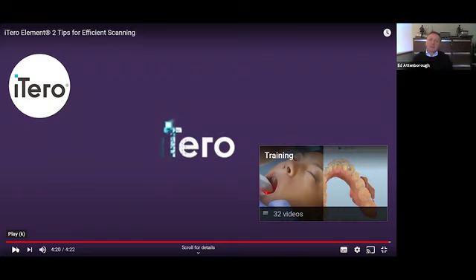The other thing to mention is the stitching, particularly as you come round the lower 2s and 3s. All of the scanners that I've seen sometimes slightly misstitch. And what happens then is that you get a slight compression of the arch. And it's quite clever, because once you scan the opposing and you do the buccal bite scan, the software places the models in virtual occlusion and works out if there's been a certain distortion of the arch, and then it kind of clicks out. You can actually see the software correcting.